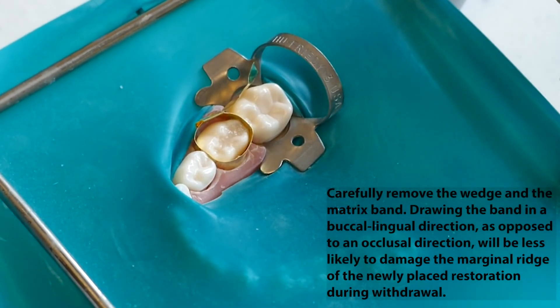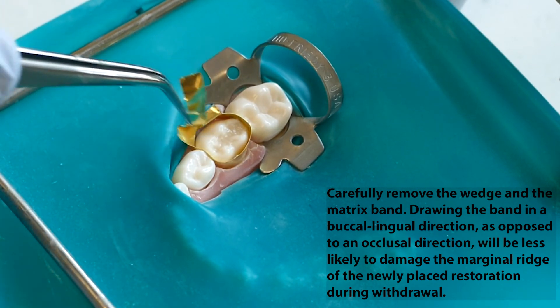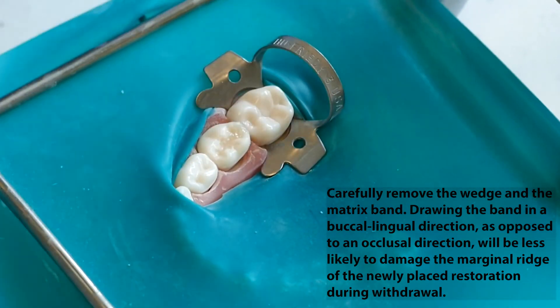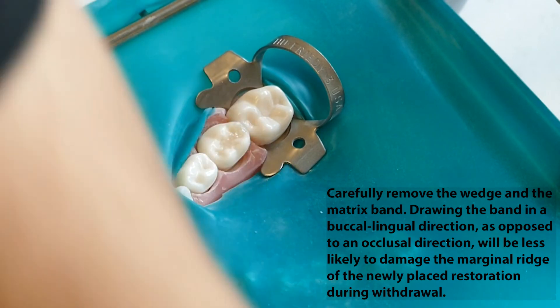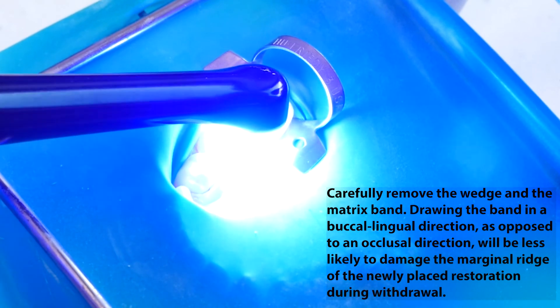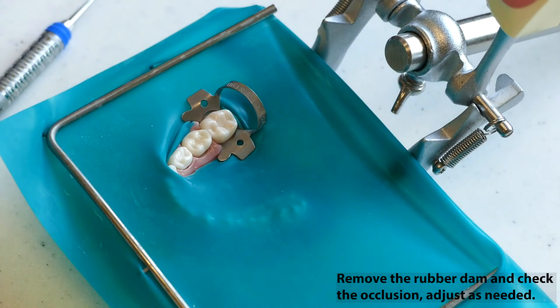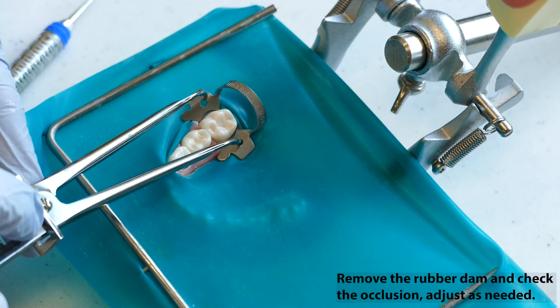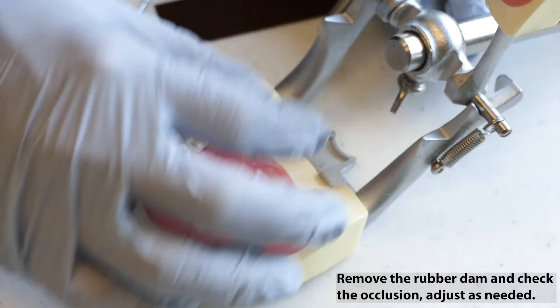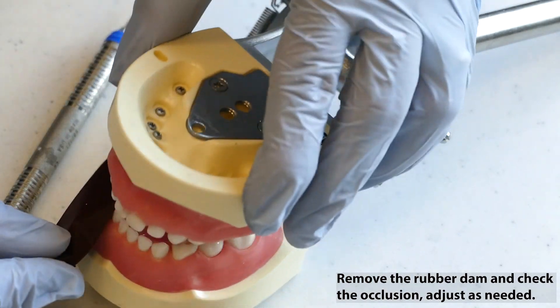Carefully remove the wedge and matrix band, removing the band in a buccal-lingual direction as opposed to an occlusal direction. This will be less likely to damage the marginal ridge of the newly placed restoration during withdrawal. After the matrix band and wedge have been removed, cure the restoration one more time, directing the light towards the proximal from the buccal or lingual approach. Remove the rubber dam and check the occlusion for irregularities with articulating paper and adjust as needed.